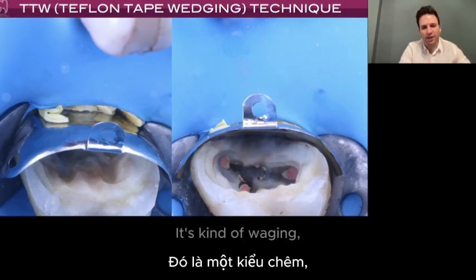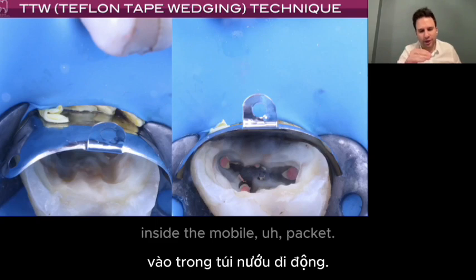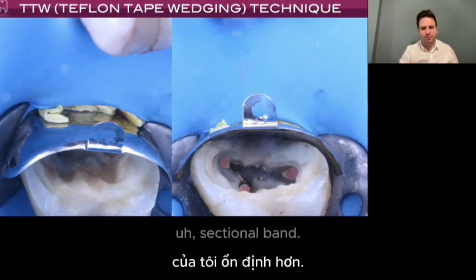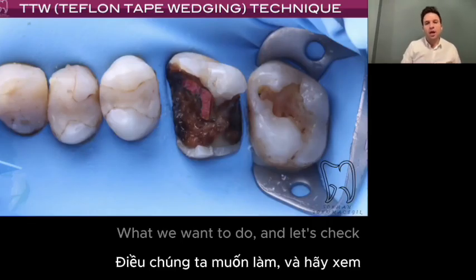It's kind of wedging, but I'm using the support of the gingival pocket, and I'm plugging the Teflon tape inside the mobile gingival pocket, and then it makes my sectional band more stable. Then you can make your pre-endo build-up or any kind of restoration you want to do.